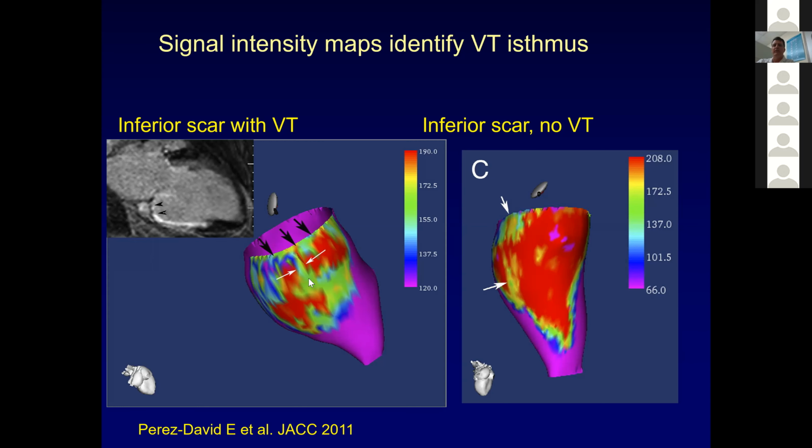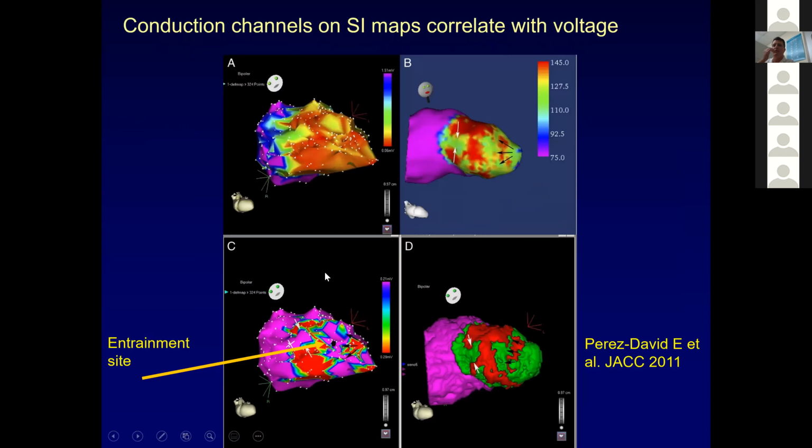This is the mitral annulus, dense scar here, and you see this little bridge here. And could this be a site for VT arrhythmogenesis? Can it predict a mid-isthmus site? This is a patient without VT, and you see basically more confluent red areas than these interrupted red areas that may indicate a lack of a channel.